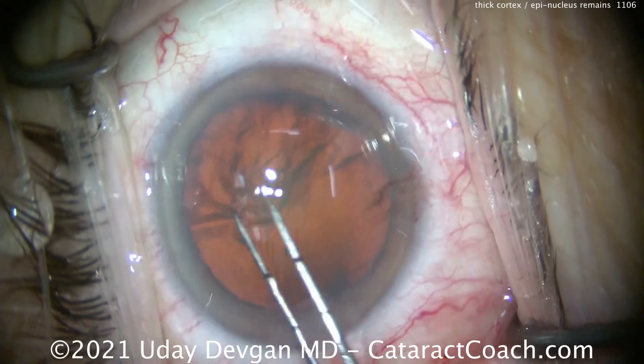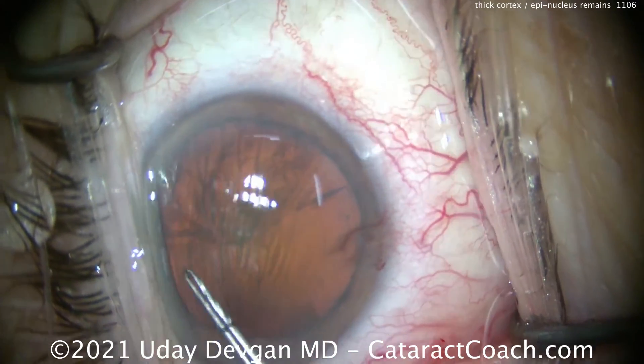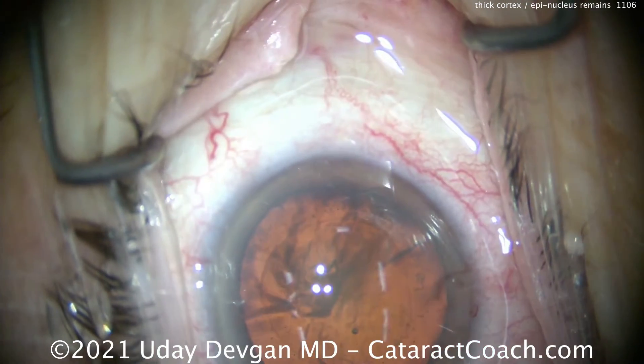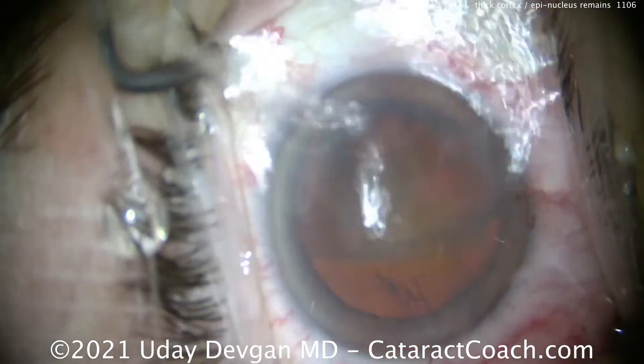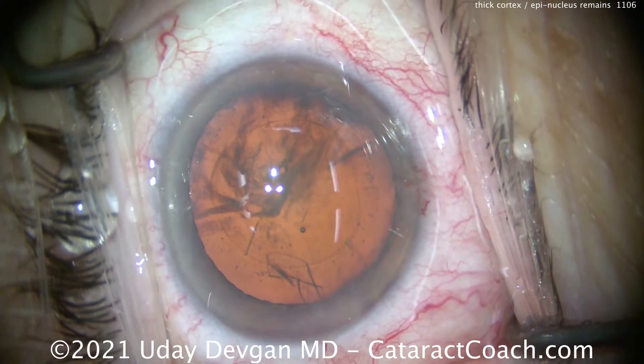Let me just show you the case and show you what leads to this. So this is the capsulorexis, and you can see it's just an average cataract. Good 5mm rexis. Here's the issue: the hydrodissection. An insufficient degree of hydrodissection.